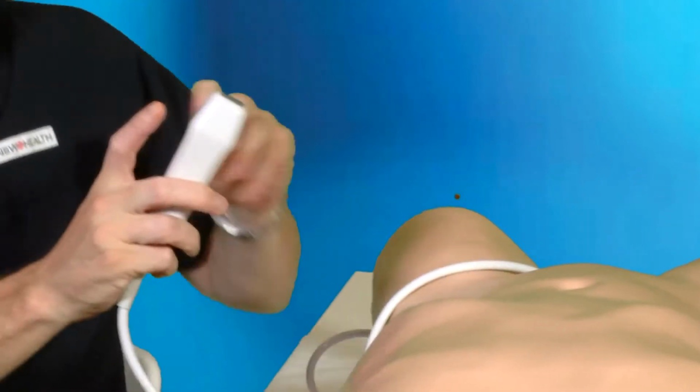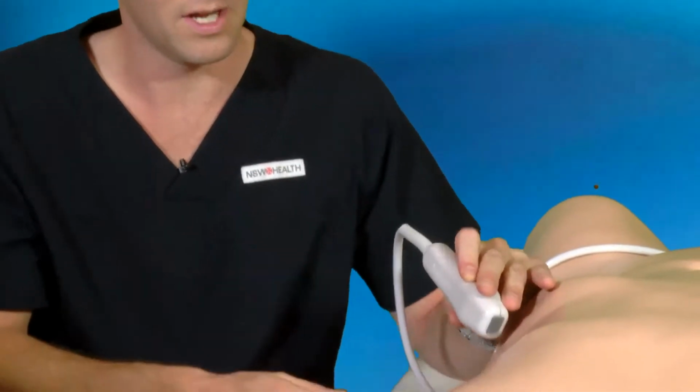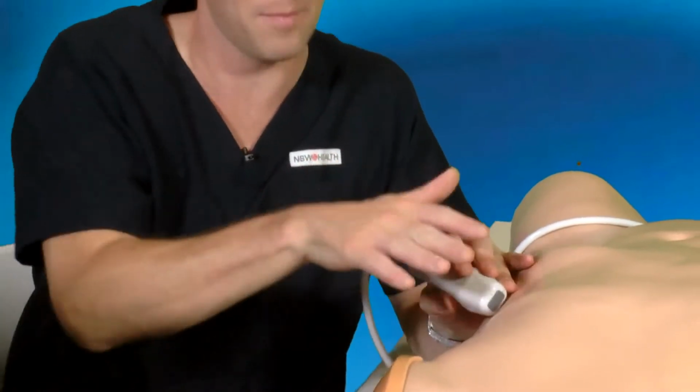Then we are going to be putting our imaging dot down towards the bed, and pointing up at about the apex of the heart. So this is maybe just down and left of the nipple, and we'll be again pointing up towards that right shoulder to try and look down the barrel in the 4-chamber view.